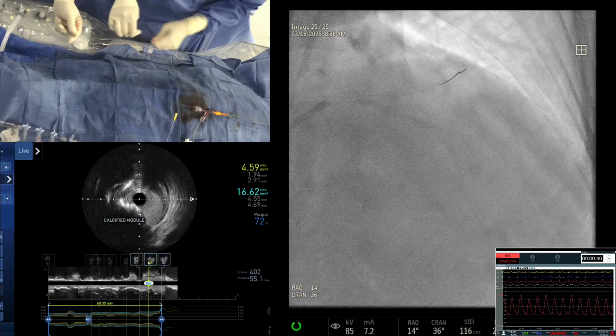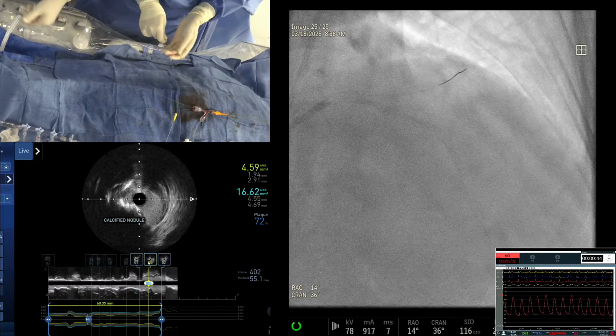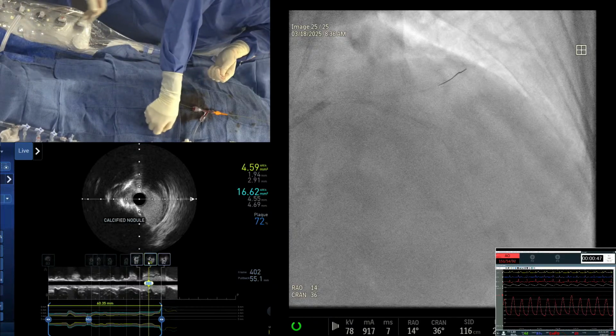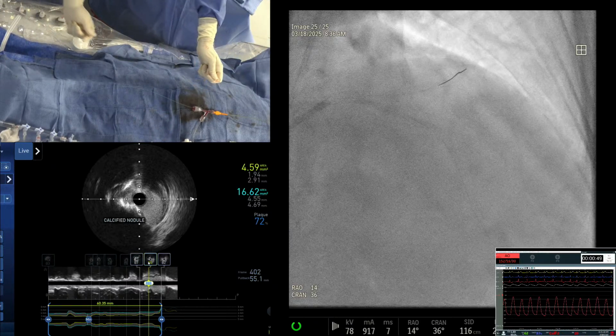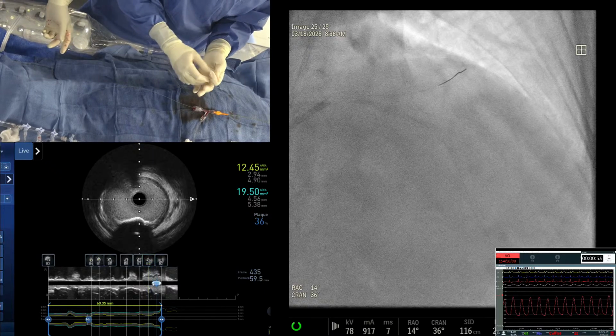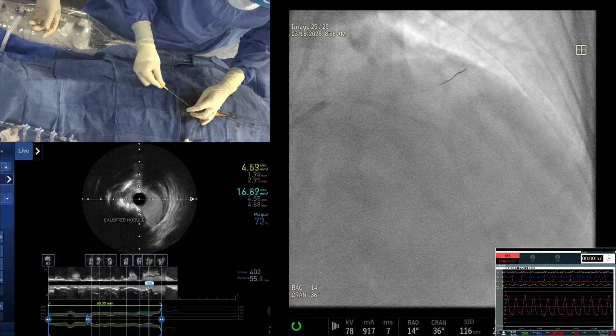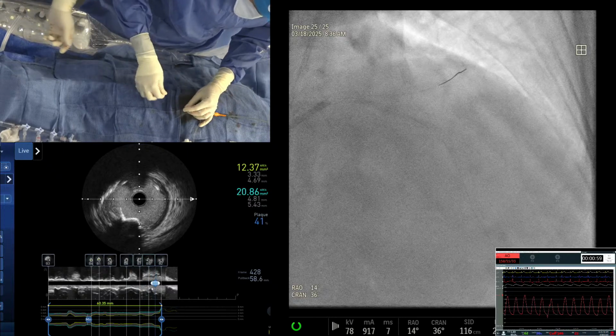Let us try on this one. If it does not work, then we go to the diag. Otherwise, we are ready. We took a 3.0 balloon, right? Yep. But then the left main will need 3.5. Usually we don't put 3 wires, but we are going to do that just to see if the IVL can be delivered.